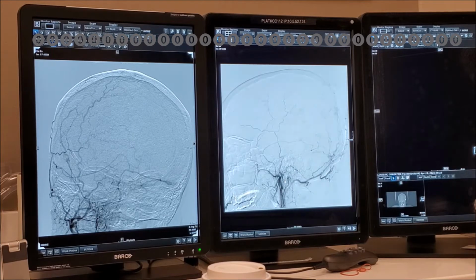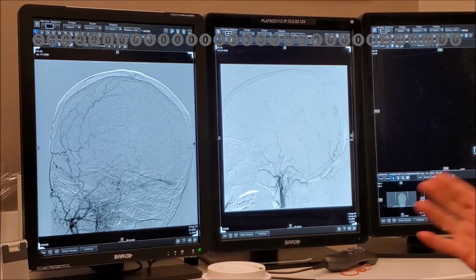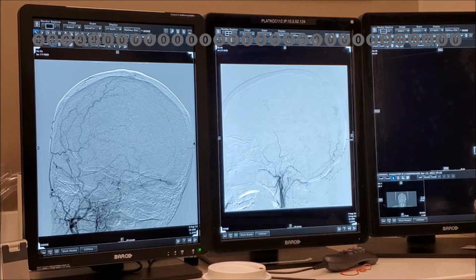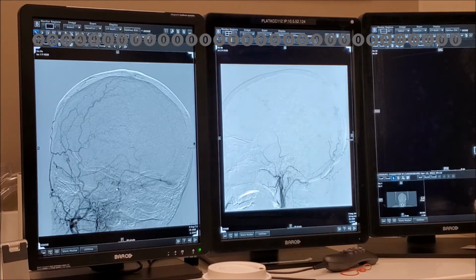Here the catheter was pointing towards the ascending pharyngeal artery. So when you look at an angio, many things help you determine whether something is an artifact from the way I injected. You should be cognizant of all those things, okay? And then you can see that there is a prominent meningeal contribution, which is probably this one here. And this one, the patient wouldn't have moved that much. We could have tried to figure out how to restore it. Okay, but hopefully you have more selective injections.